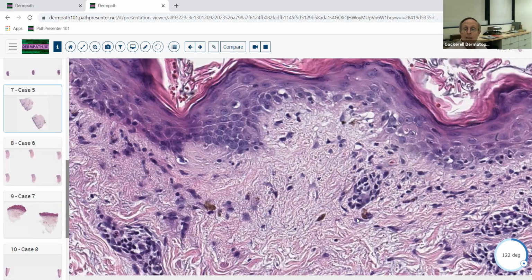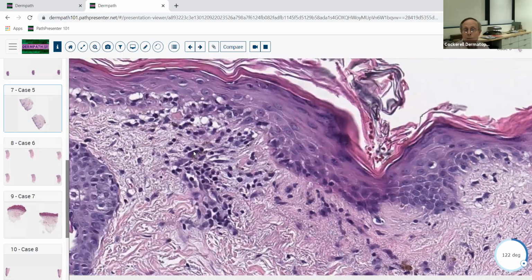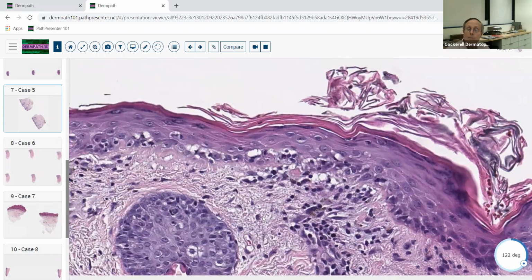We now have this MDA5, dermatomyositis can be associated with vasculitis. I don't think that would fit very well with what we're seeing here, but you can just see garden variety features of dermatomyositis in some of these other settings that have some of these antibodies associated with it that are sometimes signs of more serious systemic disease. So you really need to correlate what you see under the microscope with the clinical when you're dealing with connective tissue diseases.